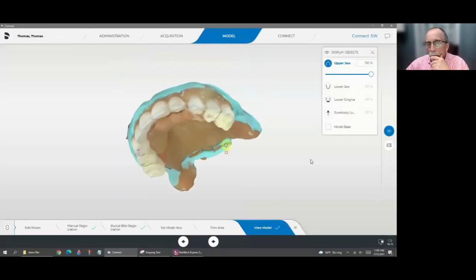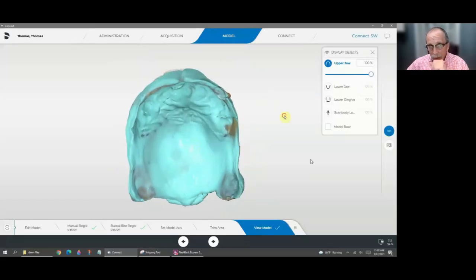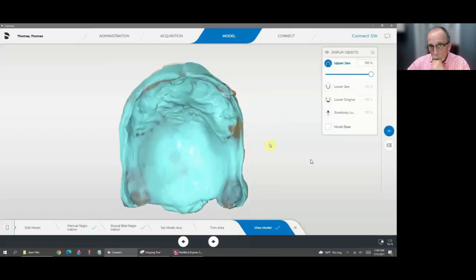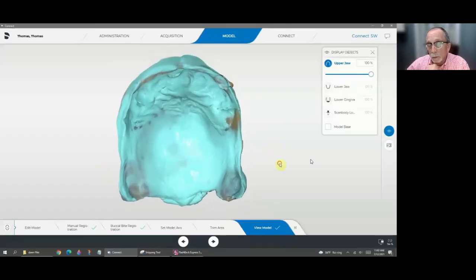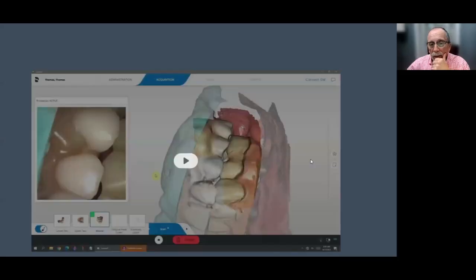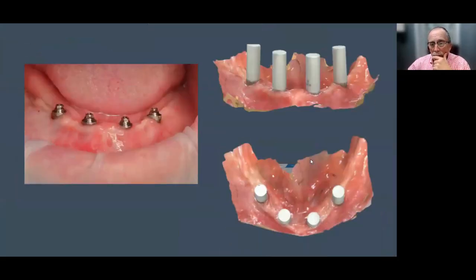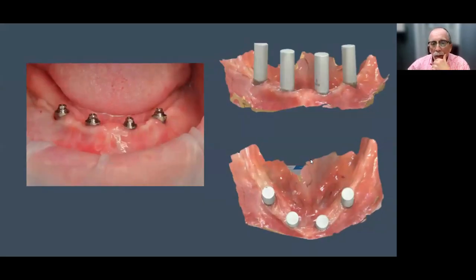There's the treatment healing denture prototype, everything's dialed in, the bite, the teeth, where we want them now. And so wash impression. And so you take that out and obviously he scanned it with his intraoral scanner. And so we have that data now. Now we're scanning the bite. And with all this data, right, the last bit of data is the scan bodies. We have to do 2 scans, one of the MUAs and then one with the scan bodies.